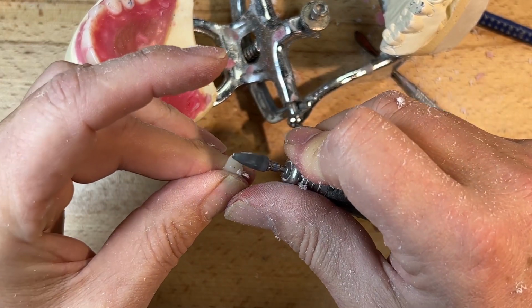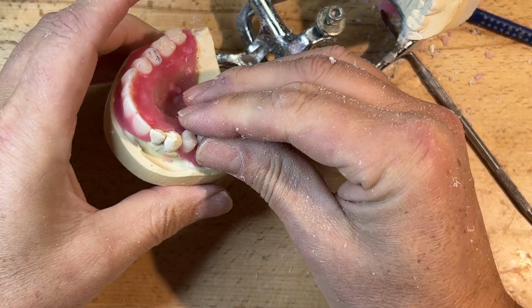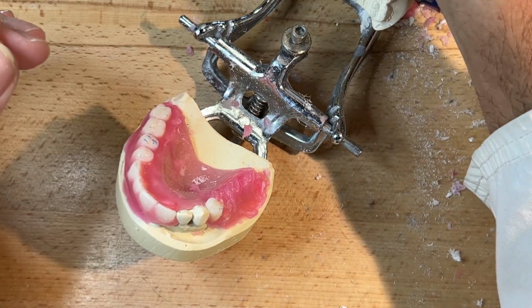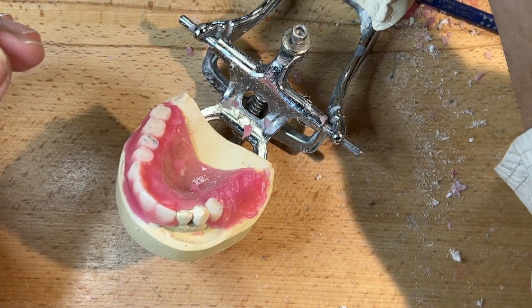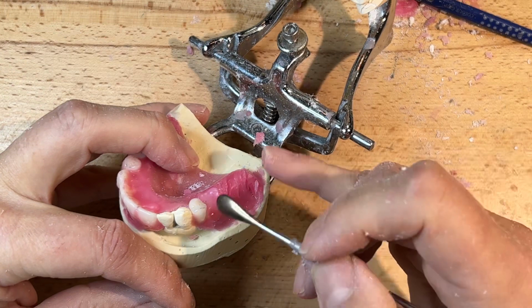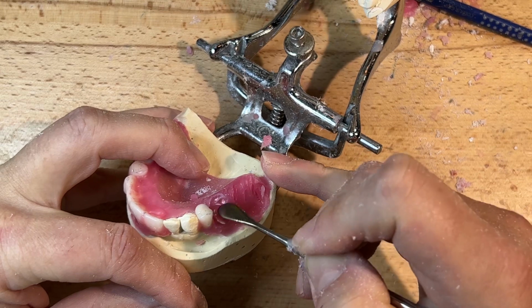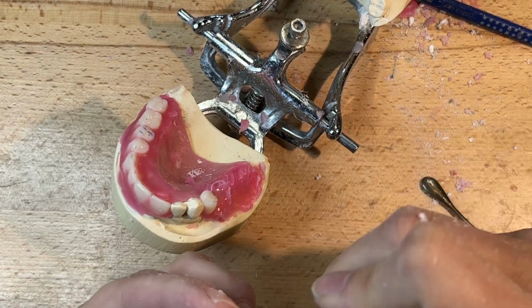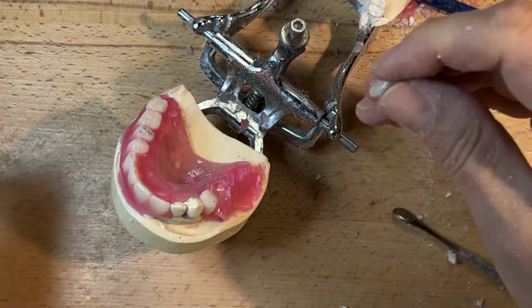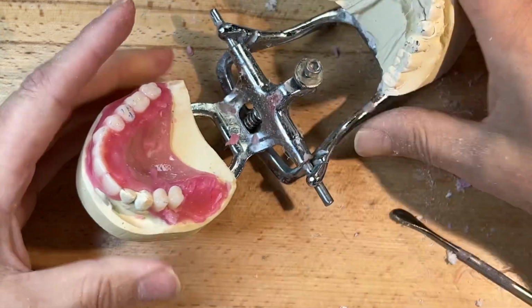But intraorally, I'll use the cloth, to give them a plug, Candulor's intraoral occlusion check. A little bit on the pricey side, but excellent because here I can control the articulator on the pressure I'm closing down, but the patient can't control vertically how much they're biting down. So I don't want any kind of eccentric markings or extracurricular occlusal contacts, so to speak.